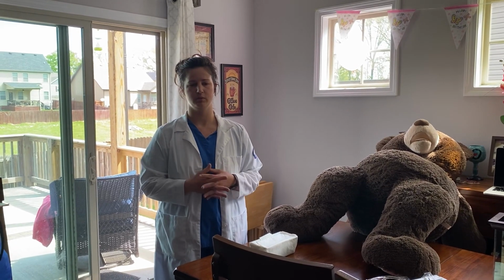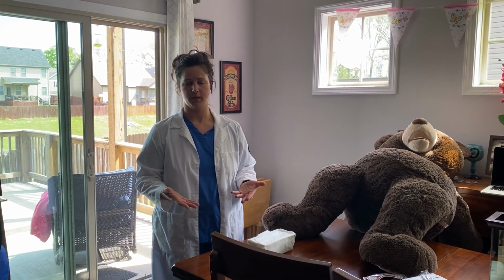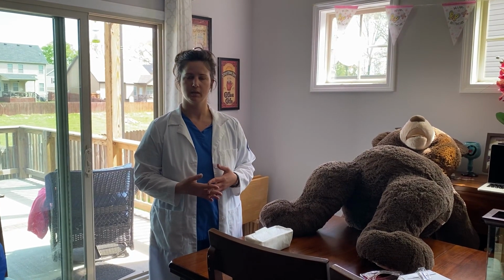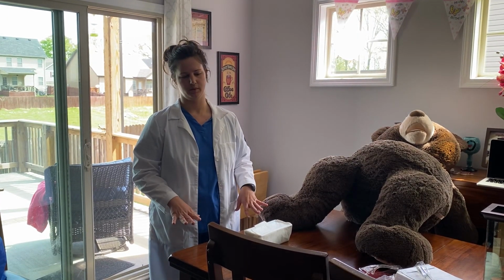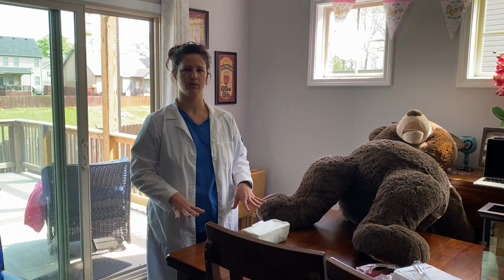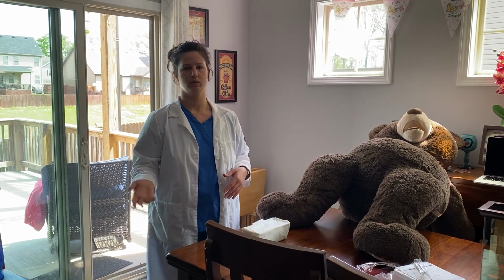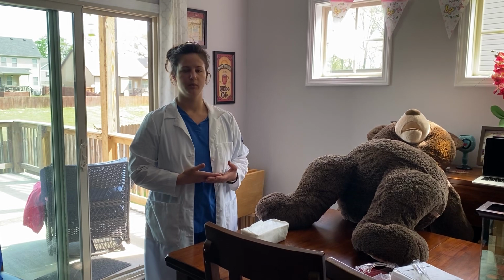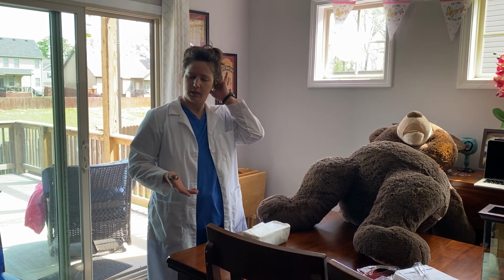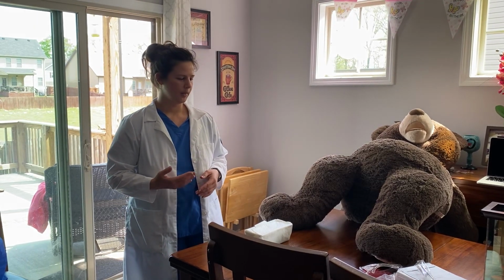Then you want to bring the bed up to the highest level for good body mechanics. You want to don PPE if indicated. Upon completion of the procedure, you want to lower the client's bed to the lowest position, raise up the handrails if indicated on the care plan, and then of course put the call light within reach of the client. And then step 12 would be, if there's any abnormal findings, report it immediately to the charge nurse. And that's it for the 12 steps.